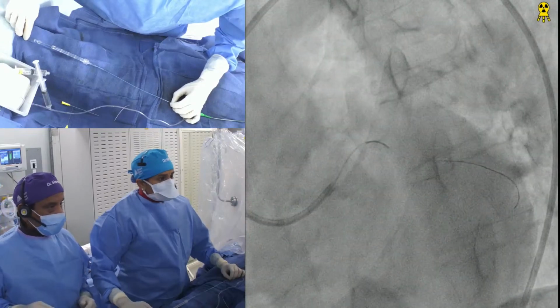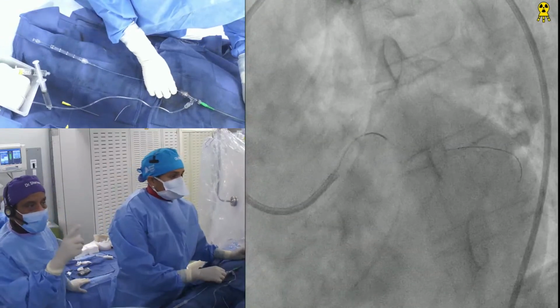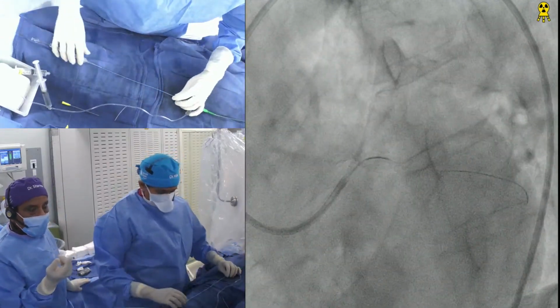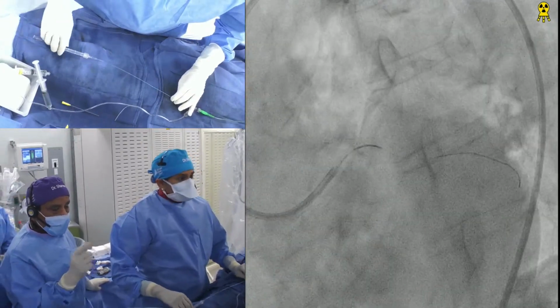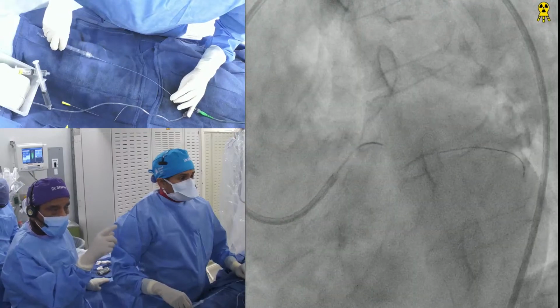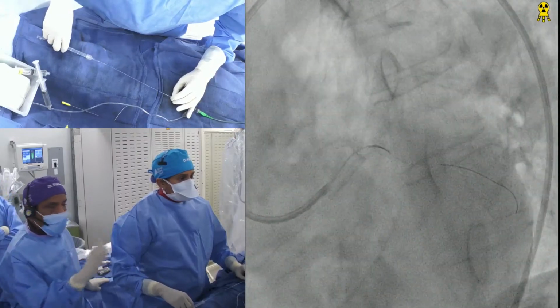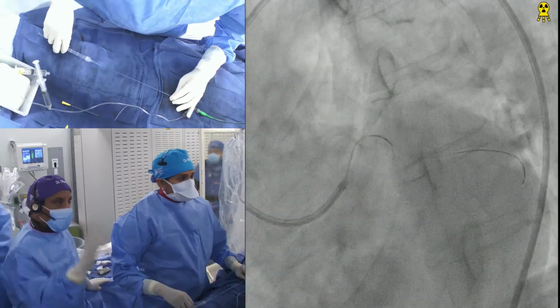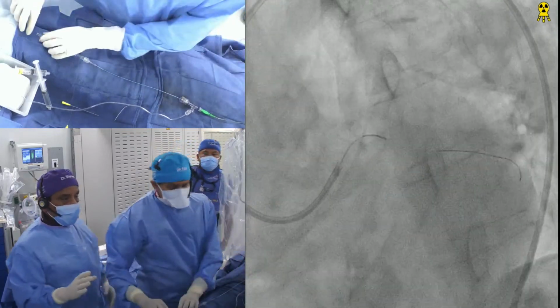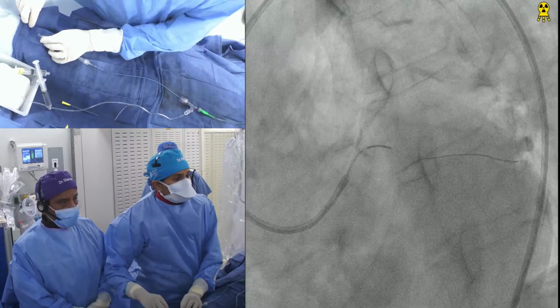So, I absolutely echo the sentiment, but I wanted to emphasize once again, look at this. This is a venture, which is basically a 2.8 French catheter. The lumen will be 1.2 millimeter, and it is not going because of that calcium. So anybody who thought initially to go and do a cutting balloon, no, it would not have gone. They would not have gone. Even this one will be a little tricky, but we will be able to manipulate this now.